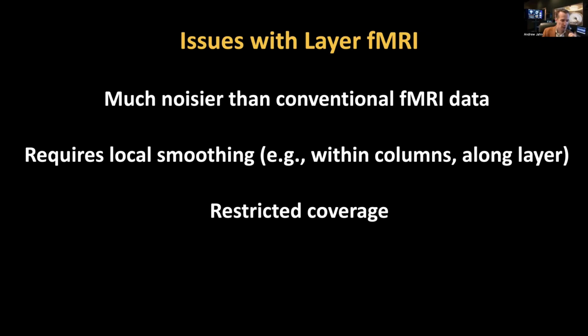If you have sub-millimeter or maybe even micrometer resolution, probably just for your own sanity and the sanity of the subject, if you're scanning a live human subject, they're not going to be in there forever, and you'll need to pick and choose exactly how many slices you want in order to acquire the data set in a reasonable amount of time.